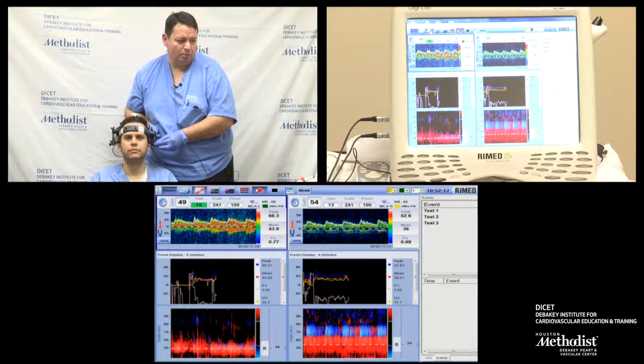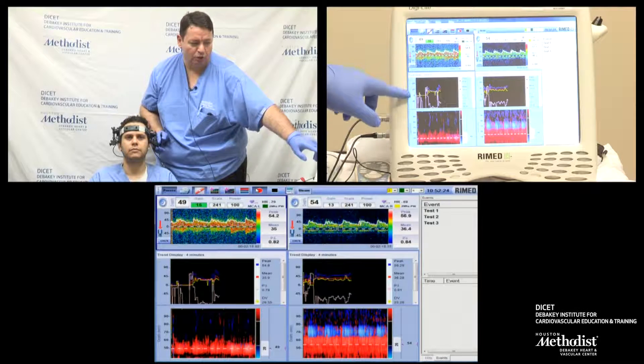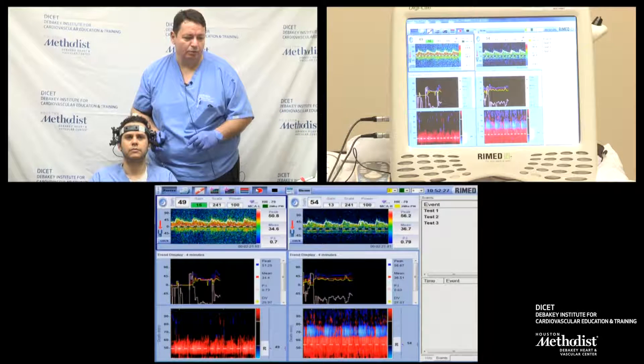These are my two middle cerebral artery signals. The bottom M-mode and the middle screen will show you the trend of the mean flow velocity and the PI values.